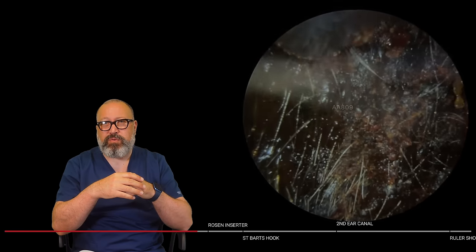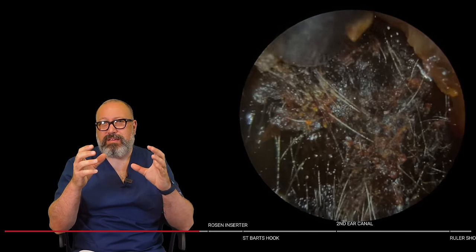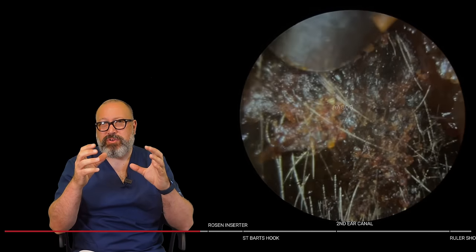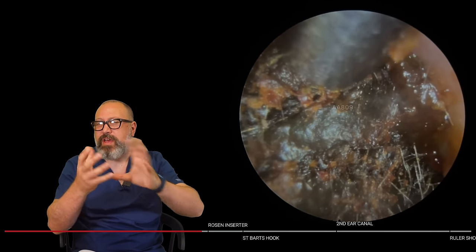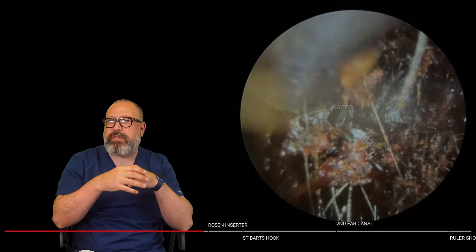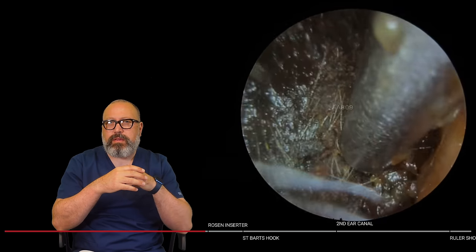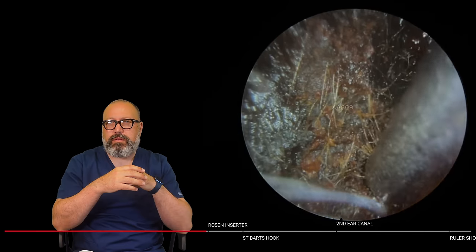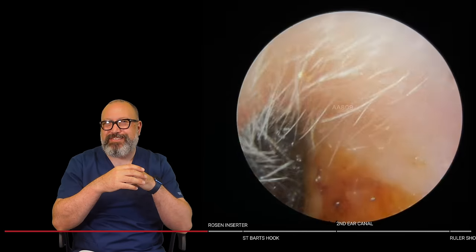Right, so we've got it forwards. Now to me, that looks a little bit stuck. I'm just going to see if we can move. Yeah, I'm trying to spin here at this point. Sometimes if you can just turn the plug enough, you'll get that little bit of a gap either side of it, and you can draw it down the canal then. There we go. I think that's pretty wedged. Yeah, it looks like it.